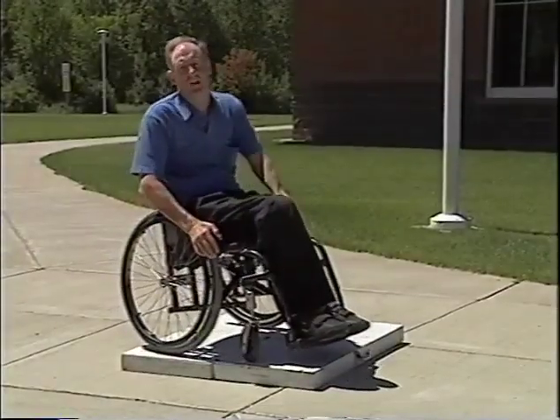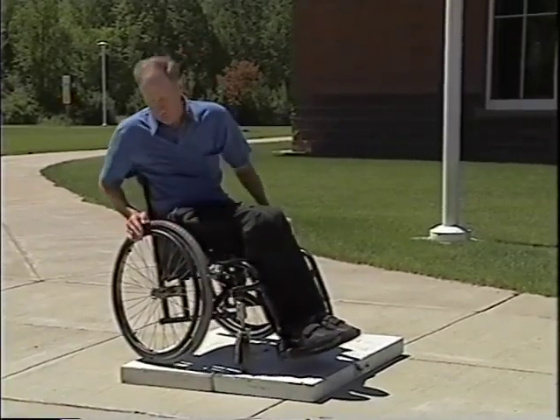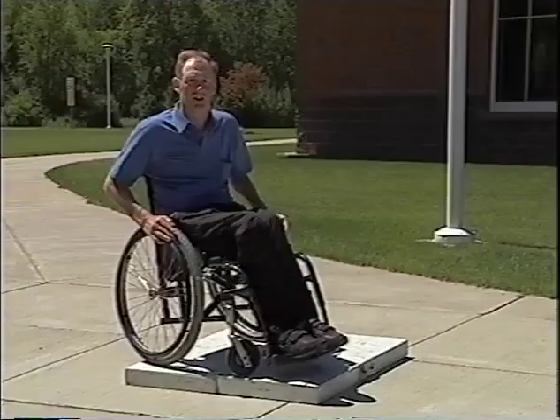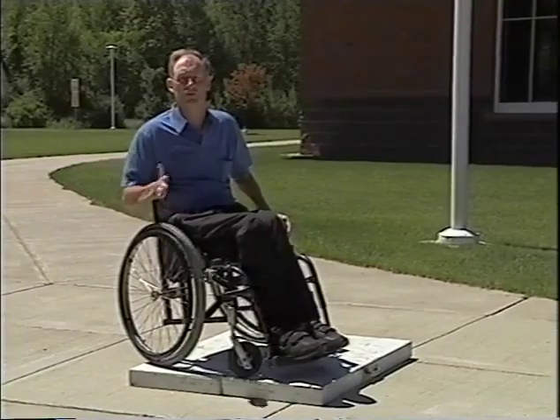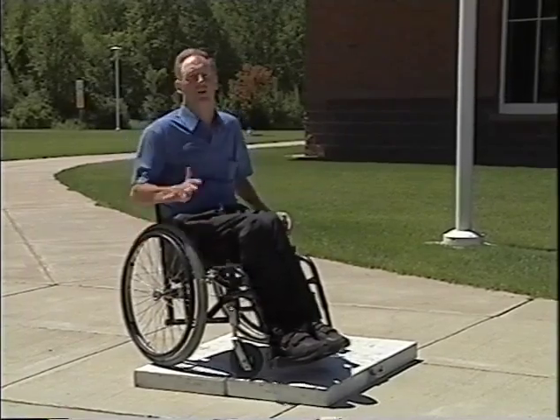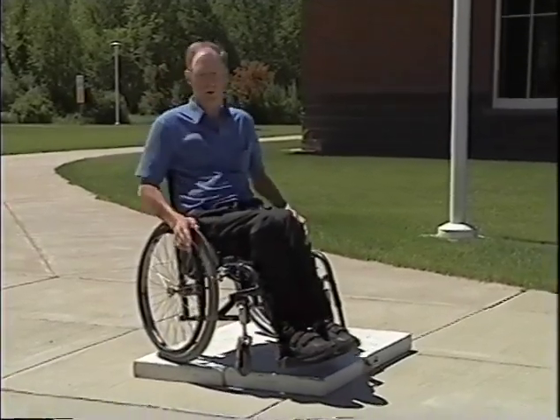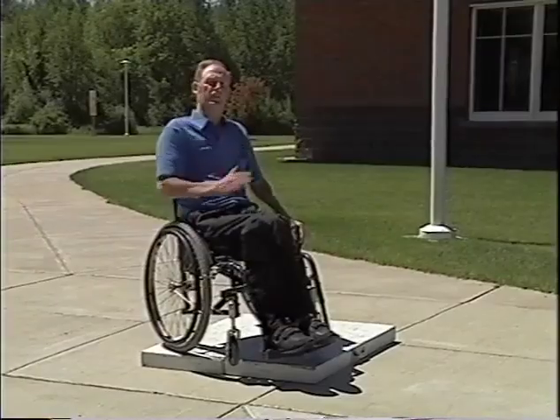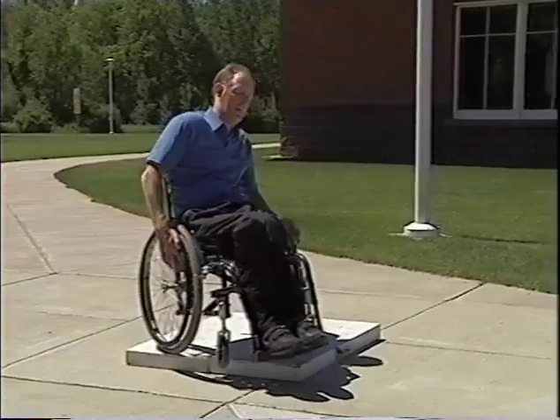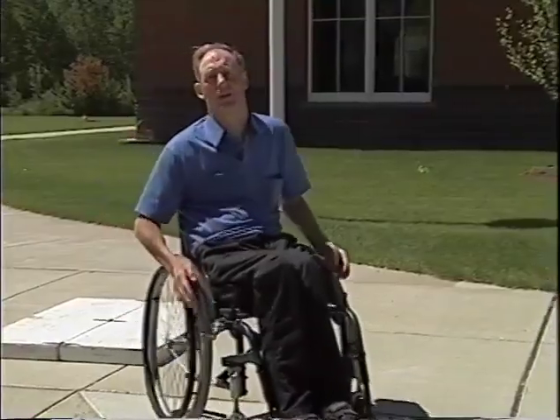Another way to teach getting off of curbs besides going backwards and forwards is going off sideways. This is something you don't use very often, but sometimes you have a case of beer in your lap and you don't want to shake it all up. Or if you're out in the woods and going over tree roots where you can't go off evenly, you don't get to pick how you're going to go off it, and that's going off on an angle. And basically, you can put your front wheel off the curb, shifting your weight to the uphill side, and then letting your back wheel slide off the curb slowly. And then you come down off the curb.